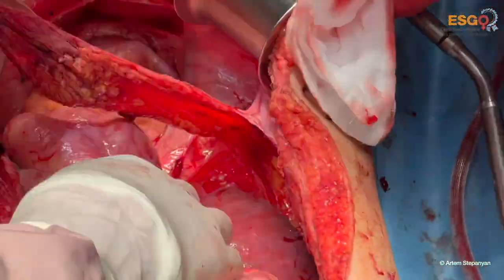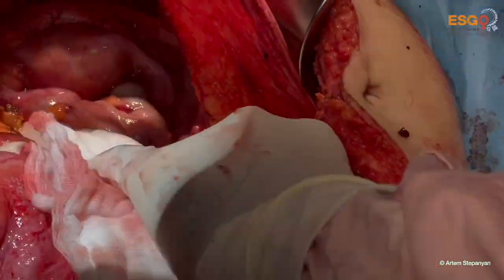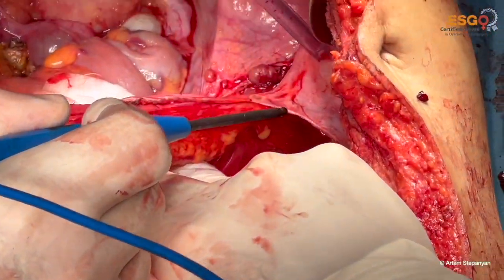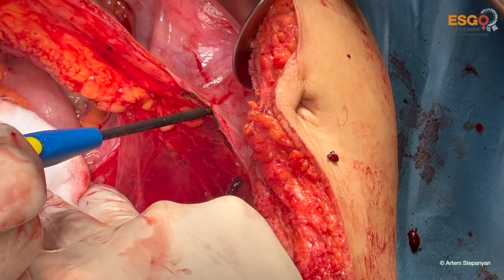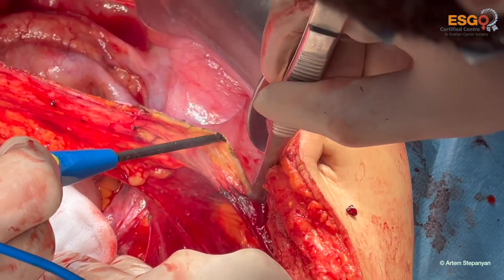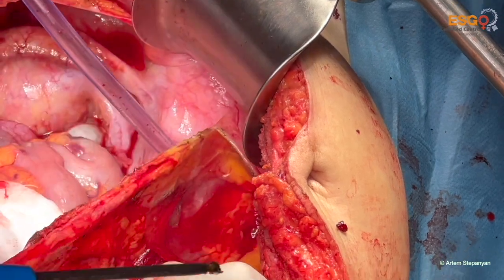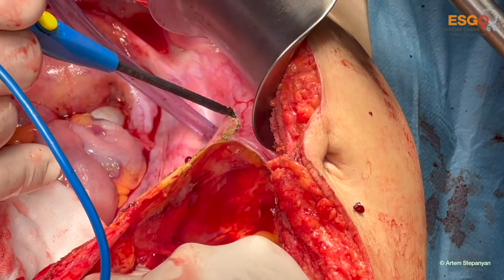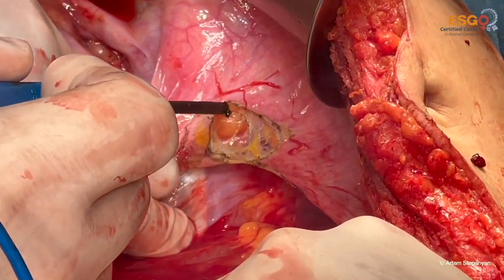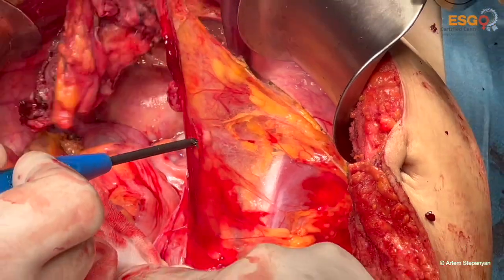This is the stripped peritoneum of the right hemidiaphragm and the right lateral canal and right anterior abdominal wall. I just mobilize it a bit again to open the retroperitoneum of the pelvis, of the pelvic sidewall. Here you see the psoas muscle.